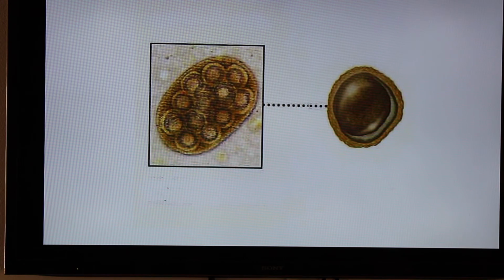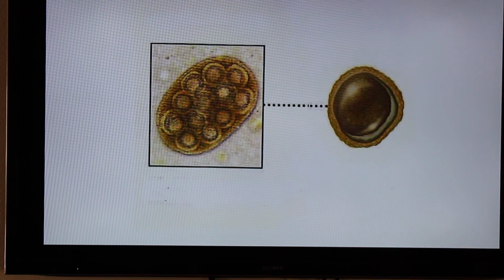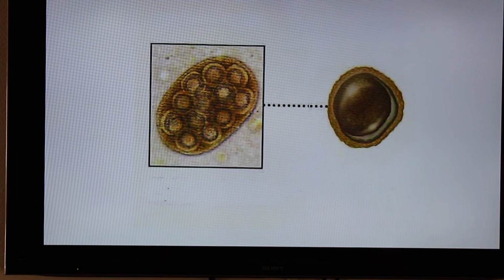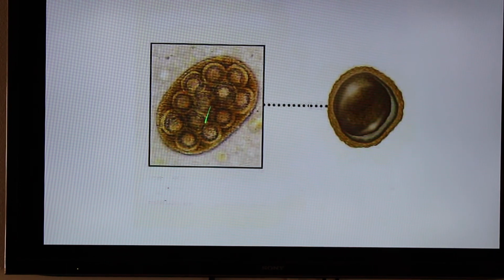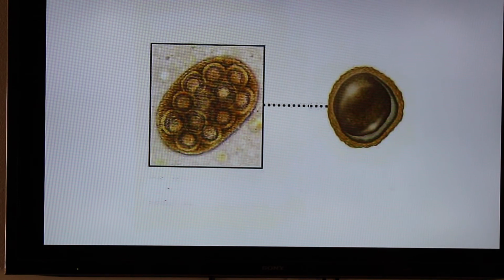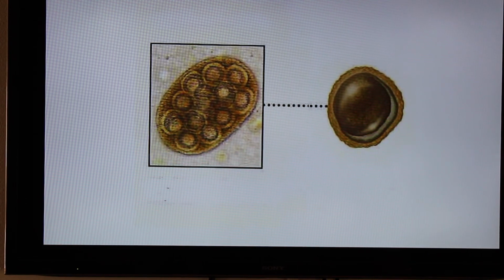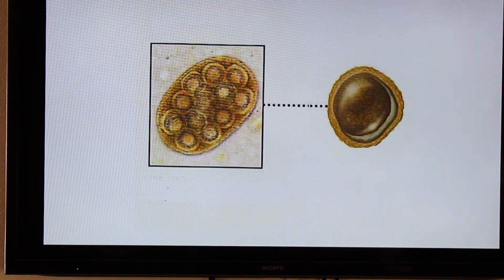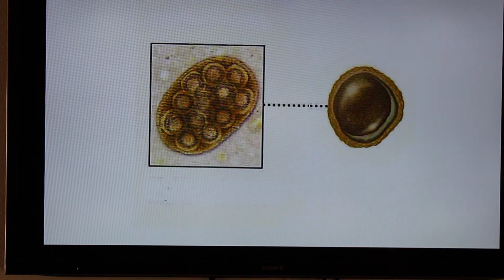This slide is one of the stock photos that we had found at some point in time that shows a size comparison between our roundworm and our tapeworm, our Dipylidium egg packet. So you can see how big it is and why it doesn't end up showing up in floats. It's too heavy. But even going back to the roundworm, it's pretty heavy too.